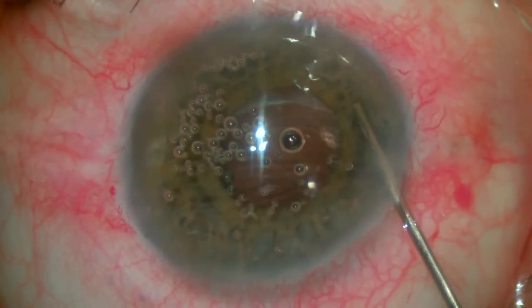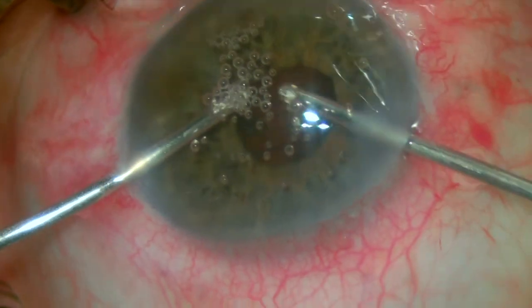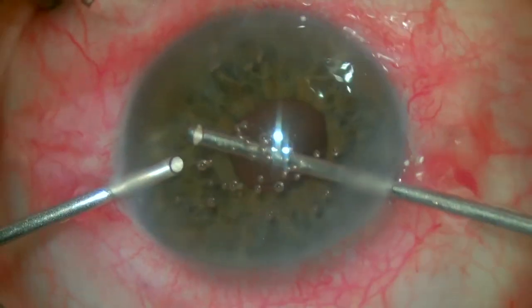We can notice that the pupil is nicely round and regular, so we move on to aspirate the OVD. Now using the machine setting in the IA cut mode, since the AC is basically all cleaned up by now.